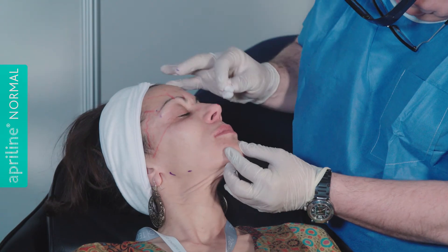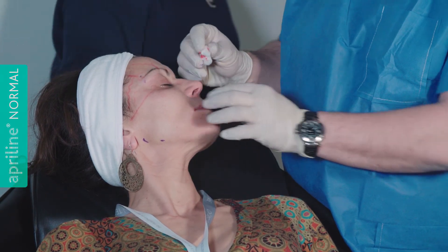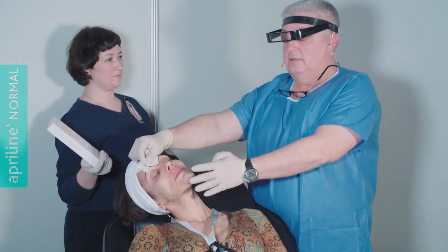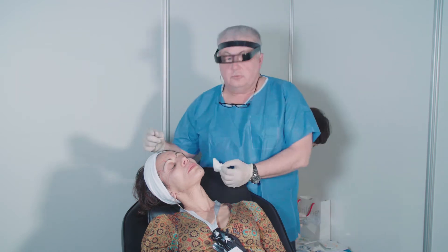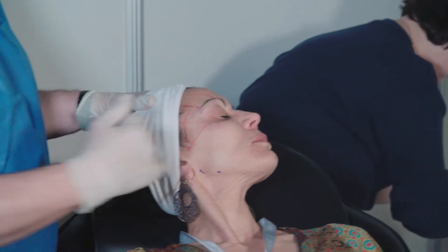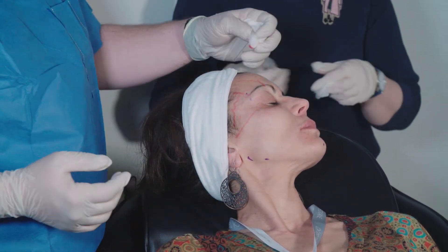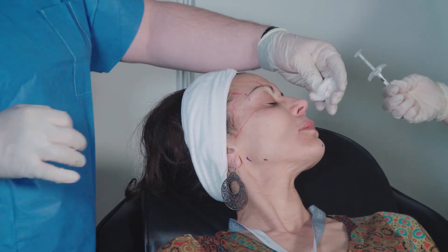If you see the profile now — you can see that you open the angle between the nose and the philtrum. You can feel this area has obtained a good support and a better position on the profile. Now you can see on the profile the columellar area — before it was inside — and you have the good definition of the columellar area and a better position of the tip of the nose with a little cephalic rotation. It's quick — you do it in one minute. It can be a little painful; sometimes you can make a local anesthesia with xylocaine in the interpoint.